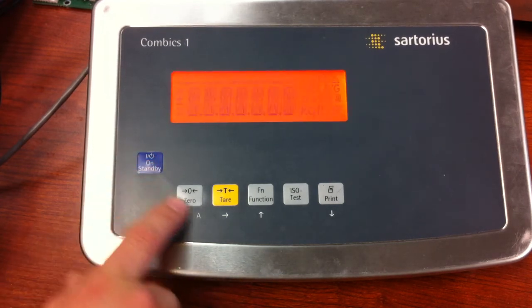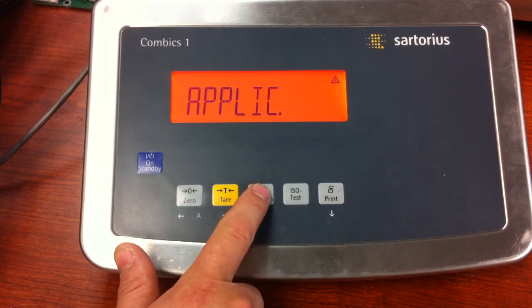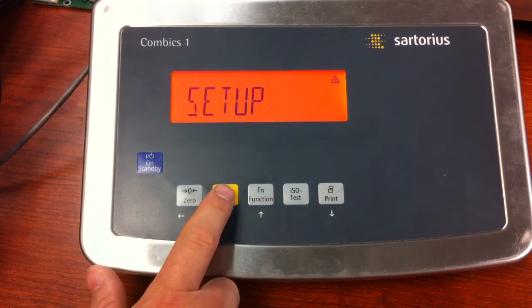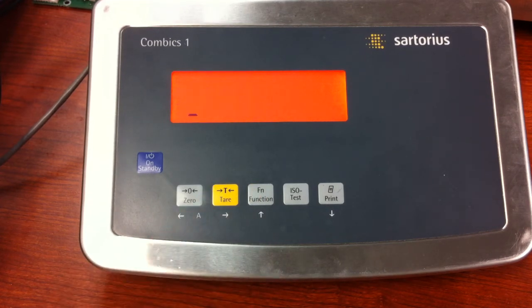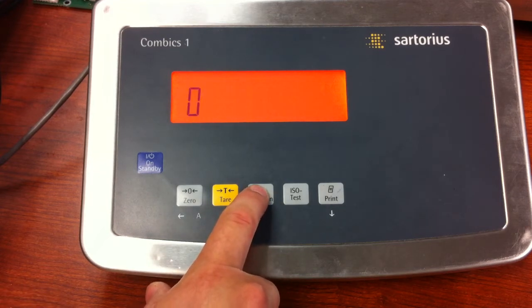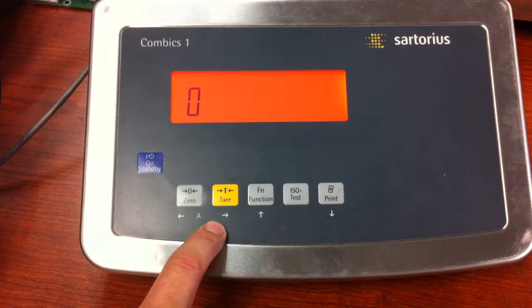Turn the unit on and press and release the tear key. Press and release the function key until you see Setup, then press and release the tear key. Now put in the backdoor service code, which is 4041-4243. Use the function key to increase the number and the tear key to move right.